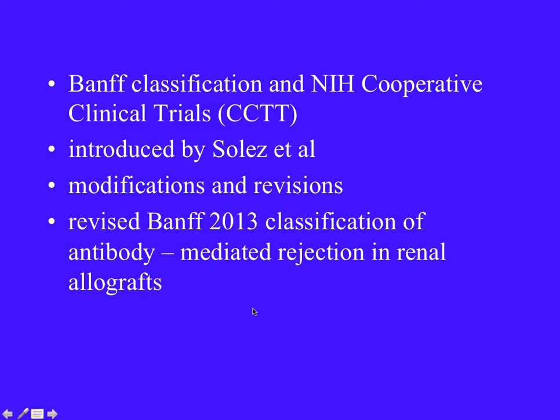The Banff classification has undergone several modifications and revisions over the last years, with the latest version being the revised Banff 2013 classification that includes updates in regards to antibody-mediated rejection scoring in renal allografts.